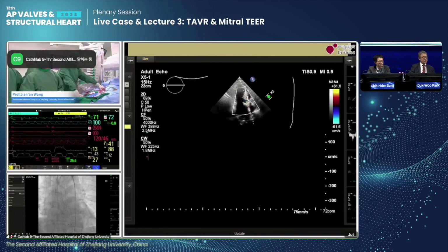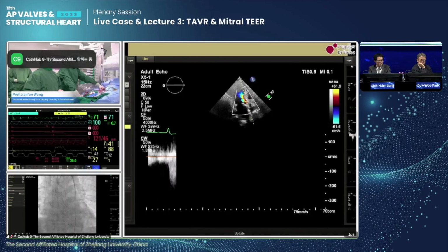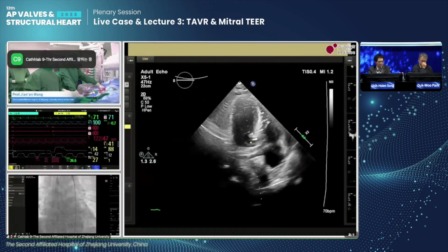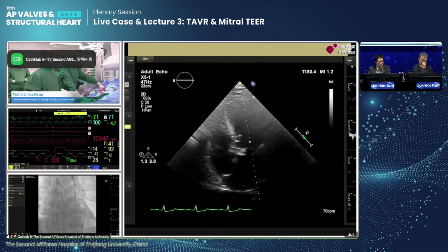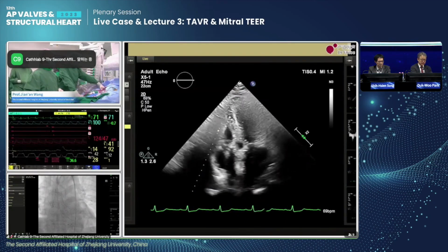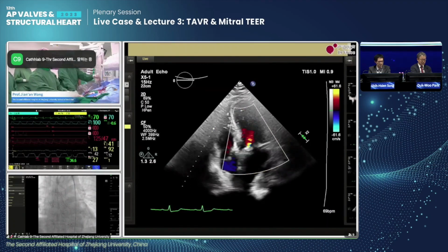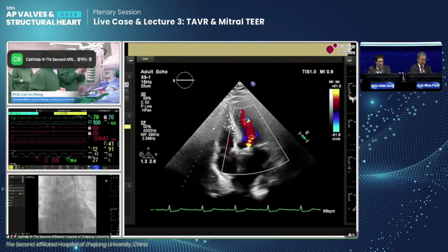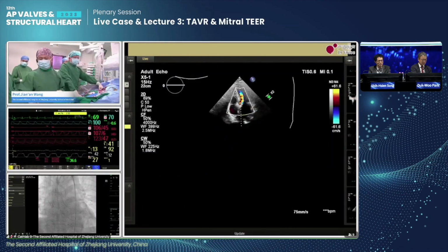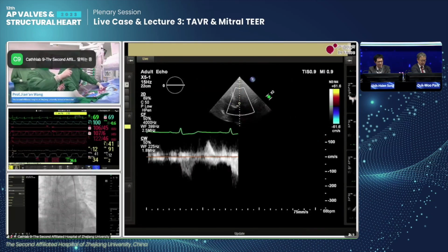Now we select, we modified our Hangzhou solution. Now we select the balloon size which is closest to the annular size but a little smaller than the annular size. Because as you know, we don't need to use a balloon bigger than the annulus. There's no meaning. So basically, you only do one balloon sizing. Yes, one-time balloon sizing.